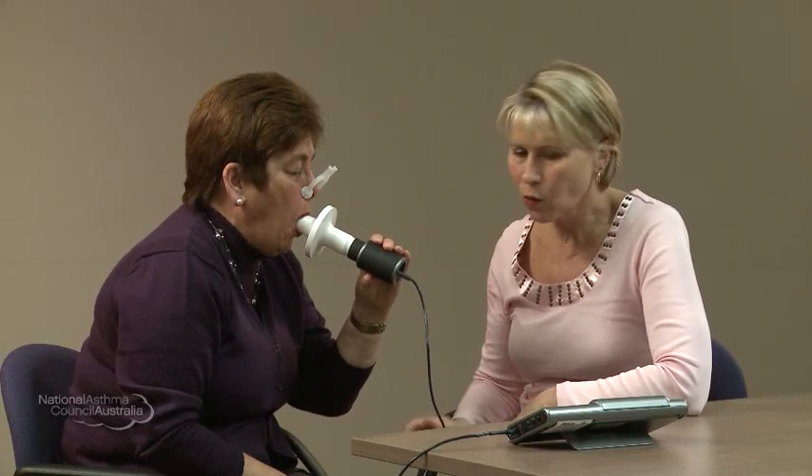Mouthpiece in and blow! Push, push, push, push — keep going, keep going, keep going. That's fantastic, all the way, all the way, all the way. Biggest breath in and relax. Well done. Good effort.